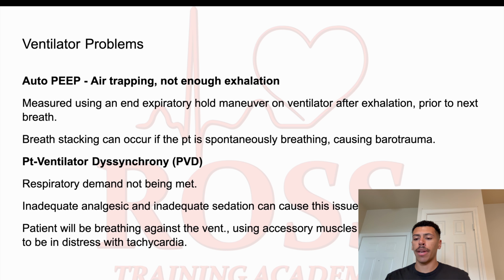You're going to have to measure this on your ventilator. It's going to be a little bit different. The steps are going to be a little bit different on each ventilator. But you're going to do the expiratory hold maneuver on the ventilator after exhalation and then prior to the next breath. And that's when you're going to start looking for those numbers.